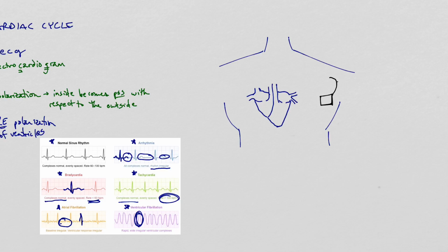Okay, you actually thread it into your superior vena cava, and so you get a tube that comes in here, and then a second one, so there's actually two wires that come out of this, comes down here, and this acts as your SA node and your AV node to keep you going. It's really, really neat.